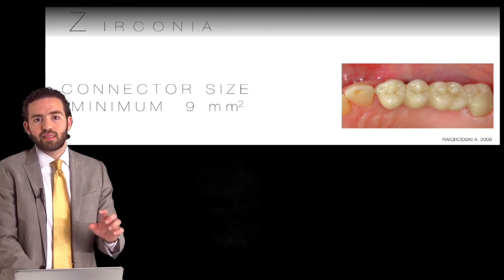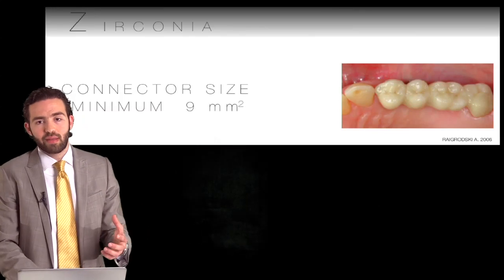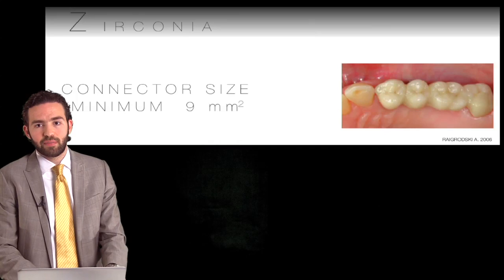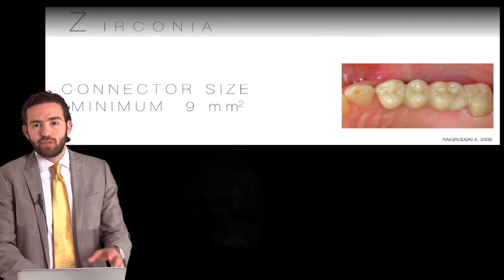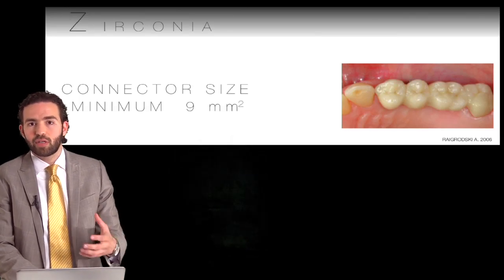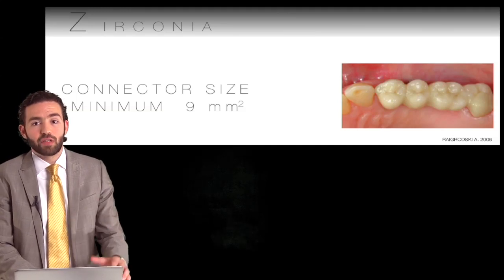The connector size has to be of a certain dimension to allow for maximum strength to reduce the fractures of it. You see in this picture from an article by Ariel Regrodsky, just note the size of the connectors. Does that really look biological, or does that really look any good for you?